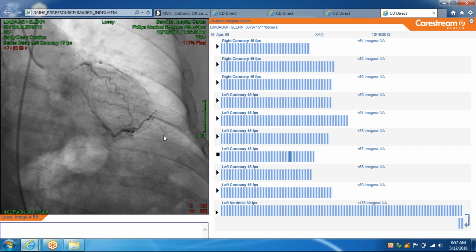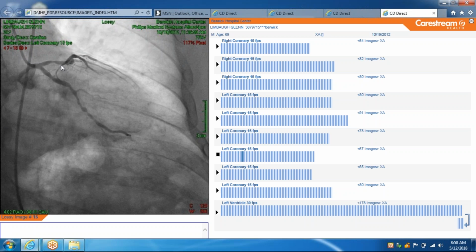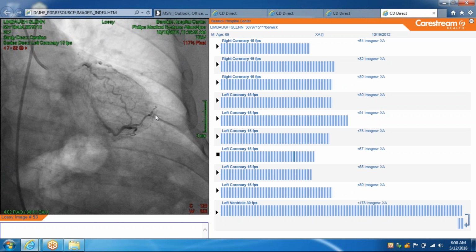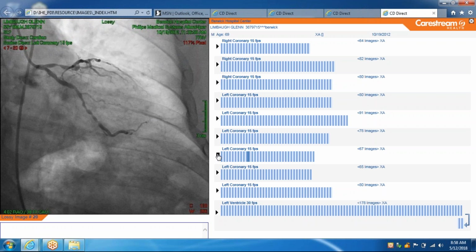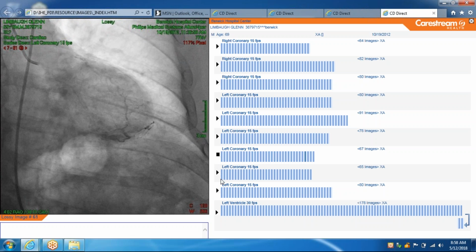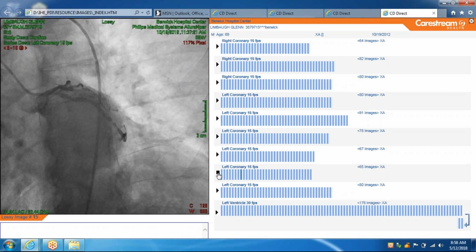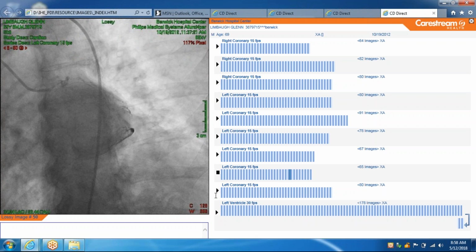Okay, so this is the LAD. It's fairly high up. So if that goes, the patient probably goes too. All right, so you can see significant blockage. So if this blood vessel completely closes off from here, all the muscle down here is in jeopardy. And you know, if that happens, usually the patient will probably succumb to the heart attack. And then take another view. That's our spider view, which wasn't all that great.